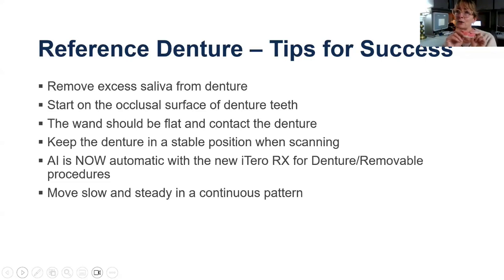And let me tell you, if you've not done this before, when you're wearing gloves and you pick up a wet denture, whoo, they are slippery. So hang on to them tightly. And I'm right hand dominant. So I hold the denture in my left hand, and then I will move the wand with my right hand, with my dominant hand. Okay. Try to keep the denture as still as possible, and you will have greater success with that.